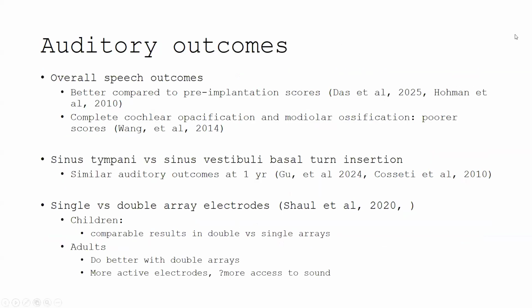It would be quite interesting to know what your experiences are with labyrinthitis ossificans. We came up with this case because the last case that we talked about, the patient that had leukemia, had labyrinthitis ossificans noted on the superior canal. His superior canal was ossified, and also the lateral semicircular canal was ossified. Intra-op, we found a thickened, almost ossified fibrotic tissue at the round window, but we managed to pick that off with a pick. We didn't actually need to do a round window drill out or a basal turn drill out. So that's why this topic.